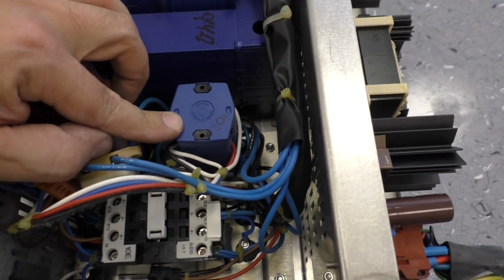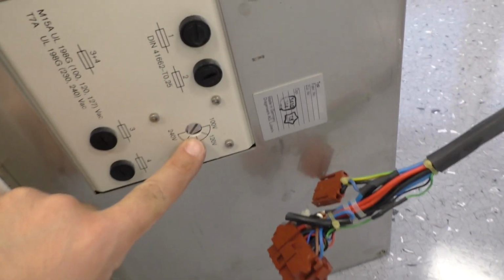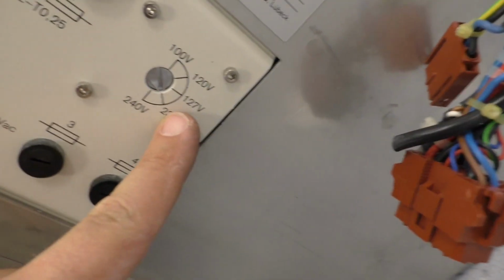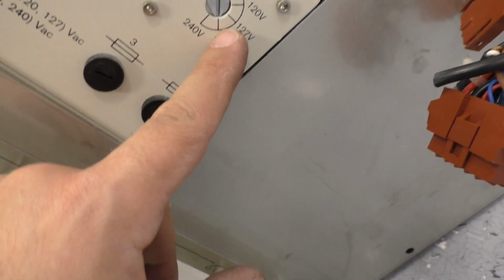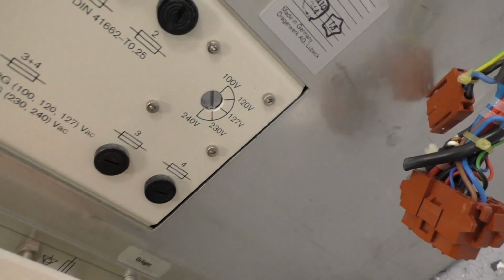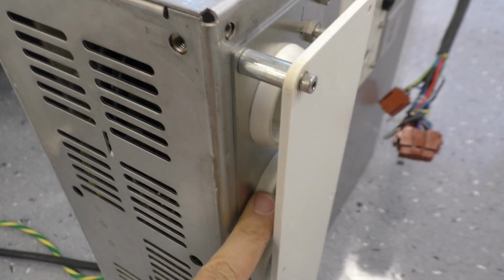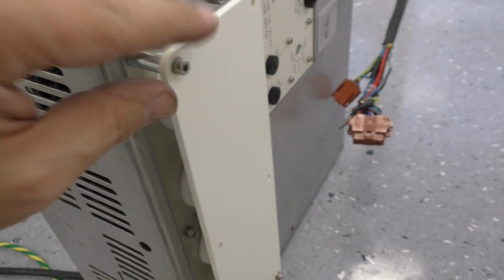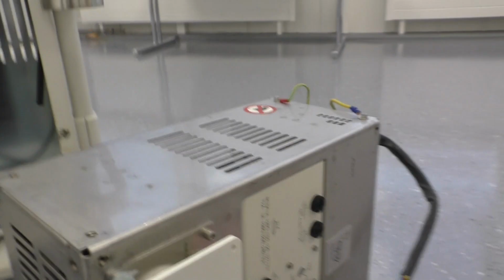Then we have the back side of a big button, a big switch. What does it switch? Oh, the input voltage from 100 to 240 volt. It's now set to 230, which is absolutely correct. And then we have some outlet plugs here, which are covered by this plastic cover.